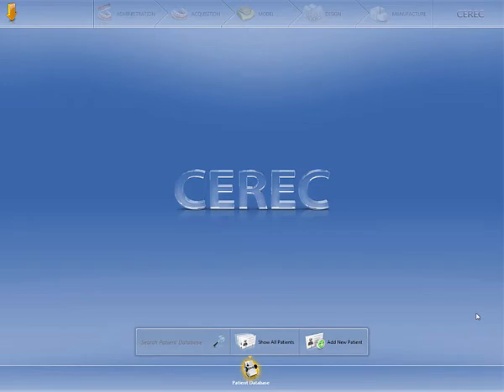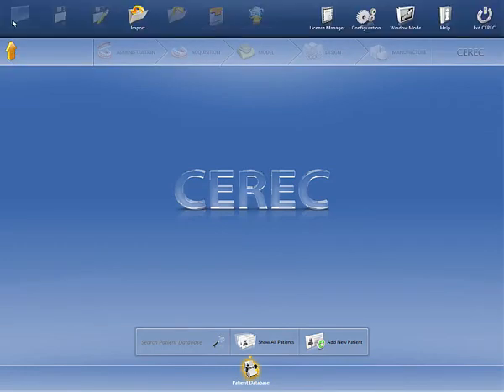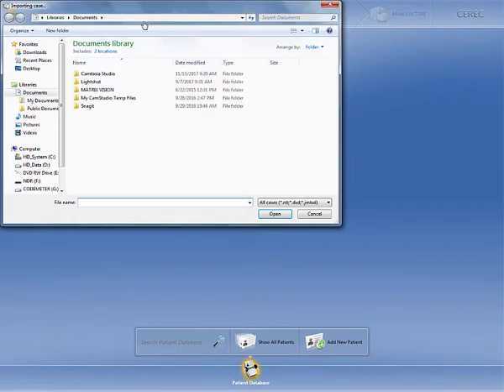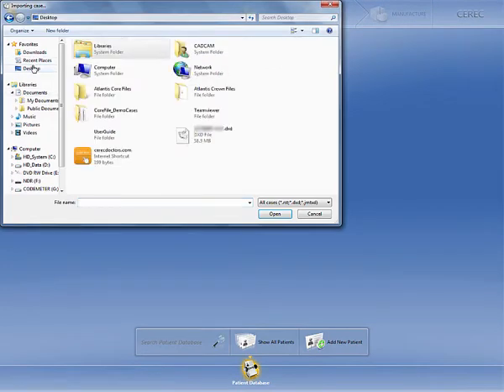In this video, I'll show you how to import the .dxd core file into your CEREC designing and milling software. Click on the orange menu button and then click Import. Navigate to where the core file has been downloaded to and open it in your CEREC software.